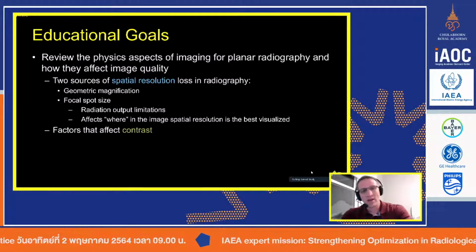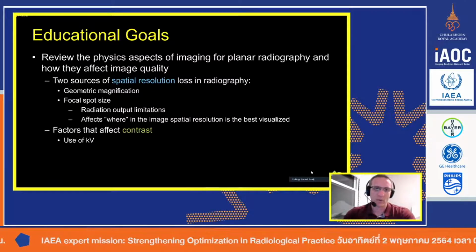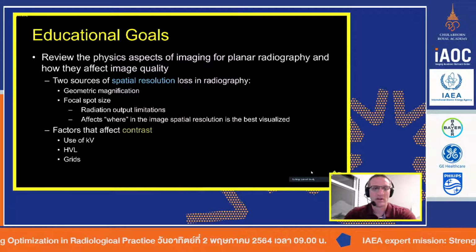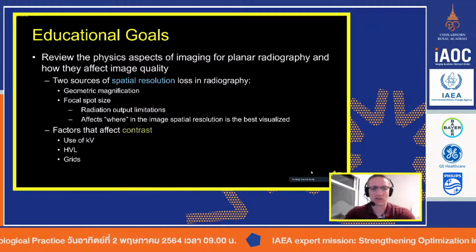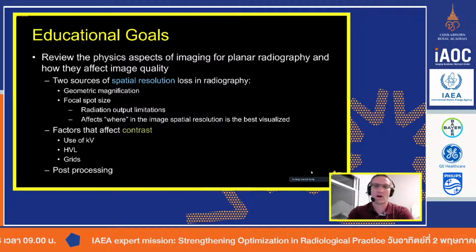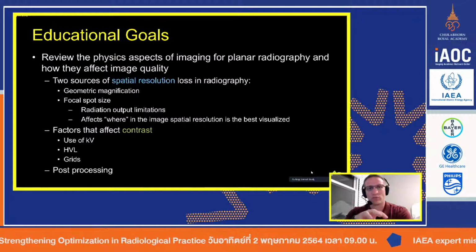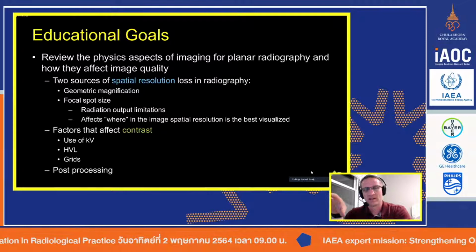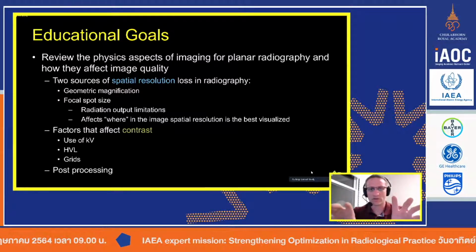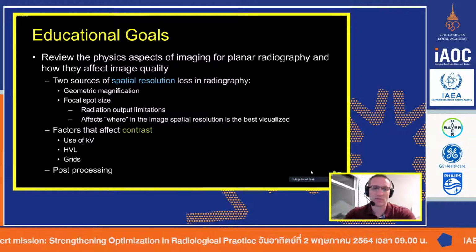We'll talk about how spatial resolution is not the same all over the image like we're used to in, say, CT, for example. And then the other aspect I want to talk about is contrast. And what are the factors that affect contrast? Well, we know kV and the beam quality, which we could define as half value layer, and then some of the components that we use, such as grids. And we're going to then talk about the post-processing software that all of the X-ray, DR and CR systems have, and how the post-processing actually will greatly affect how the image looks at the end. And so we obviously want to make sure we acquire the right image with the right technique, but then I'll show you how using post-processing techniques we can actually modify and still do our best to get the best image, even if the image quality is not the most ideal.